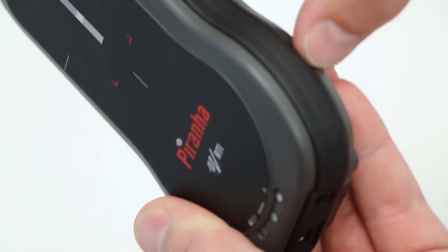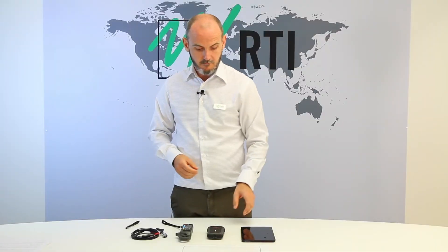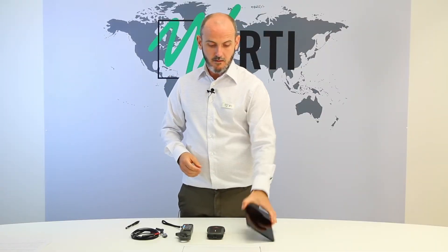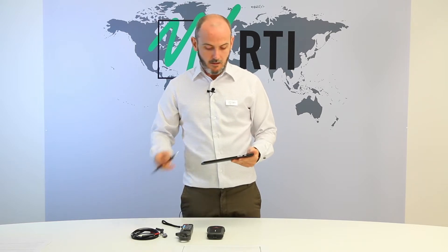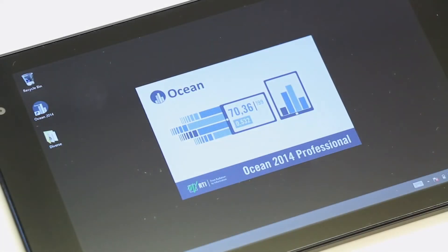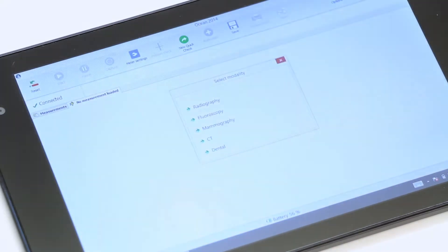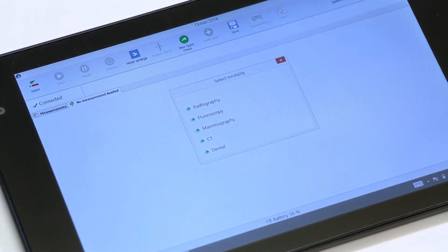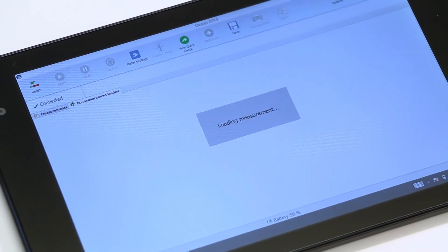To begin your first measurement, simply switch on your Piranha, switch on your tablet and start Ocean 2014 by tapping the icon. Ocean will now automatically connect to your Piranha, recognize the model and suggest the appropriate settings for your possible measurements. Simply tap your preferred settings.